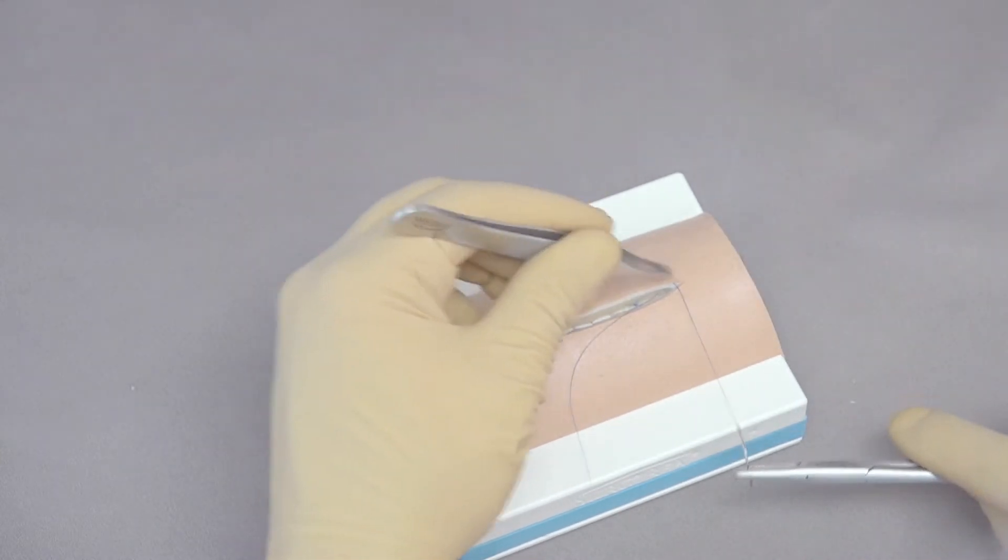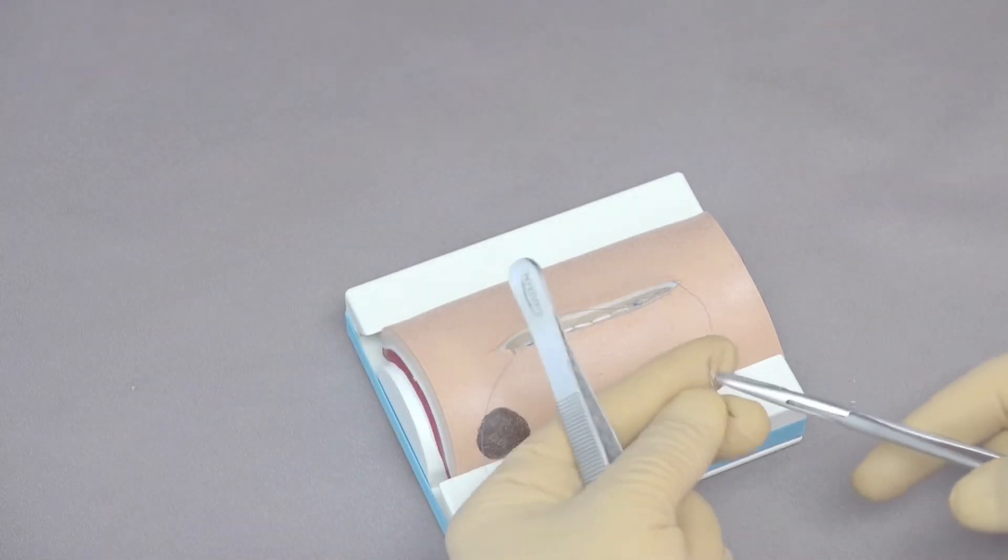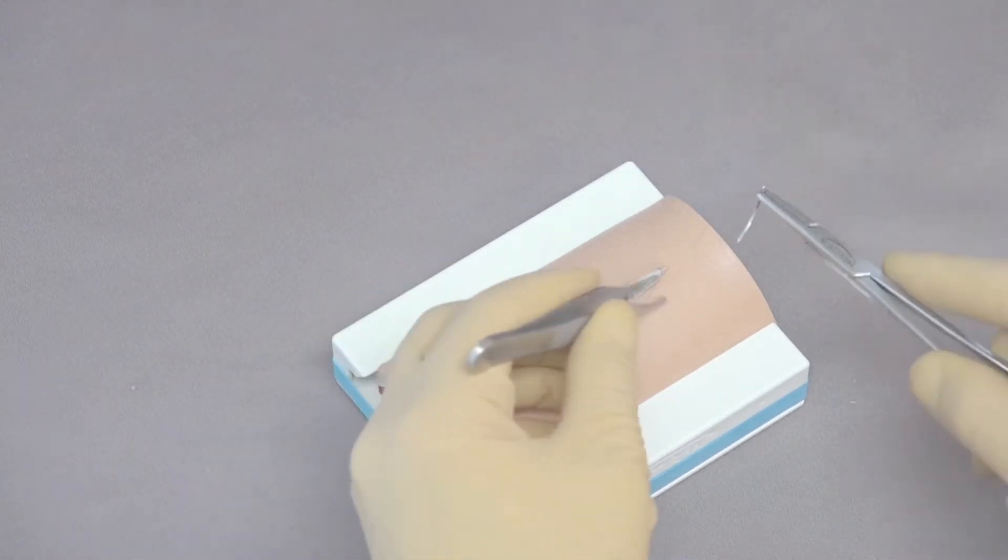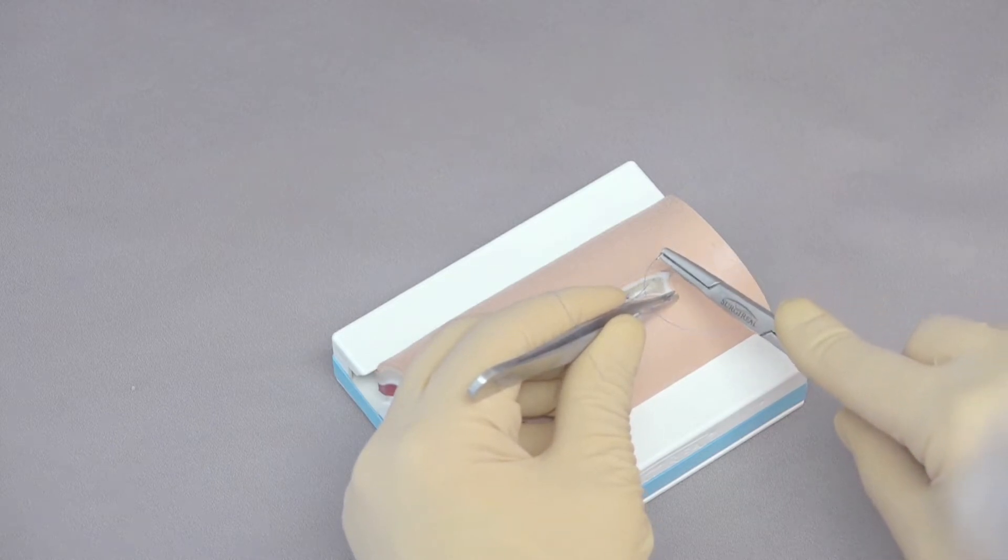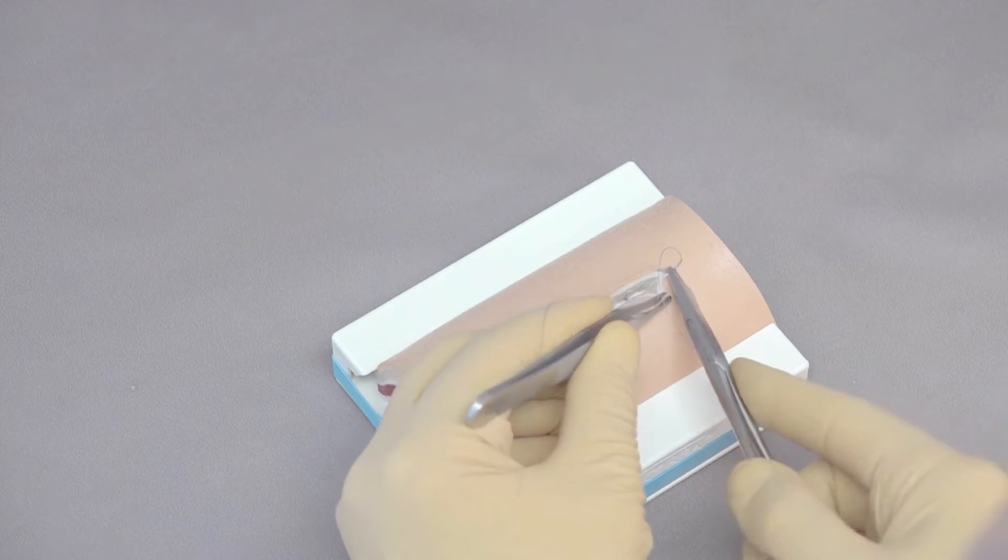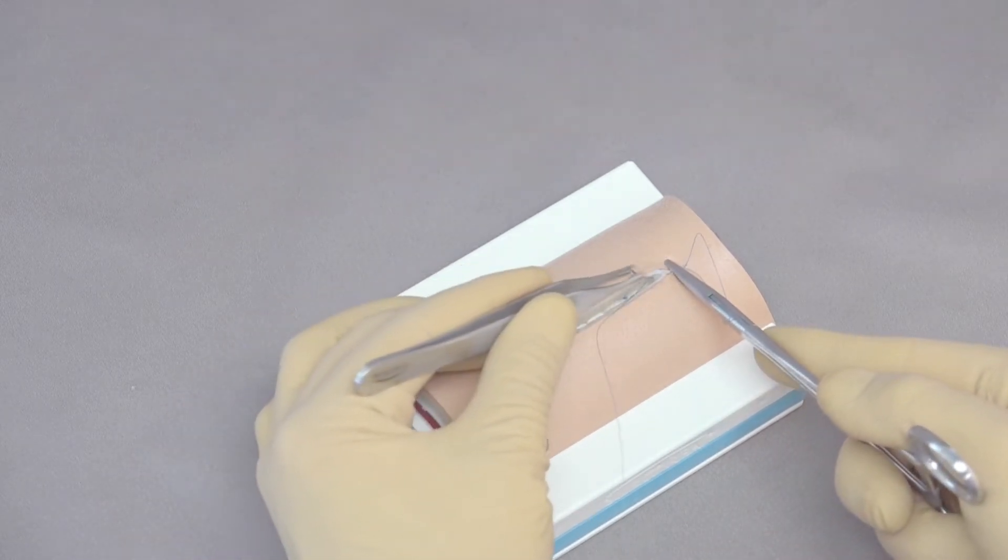We've got our suture coming through. You can see we're below the epidermis. The pink is epidermis, the dermis itself is white. And because we're backhanding makes that more challenging. Then we're going to come back on the near side now and put the needle just at the junction of the dermis and epidermis back through the dermis to have the needle come out right where the needle went in on the first one.